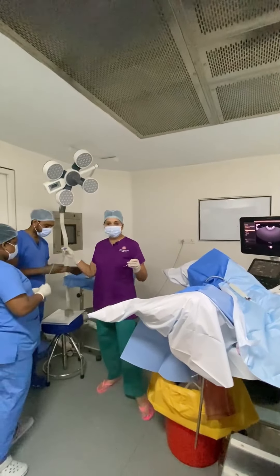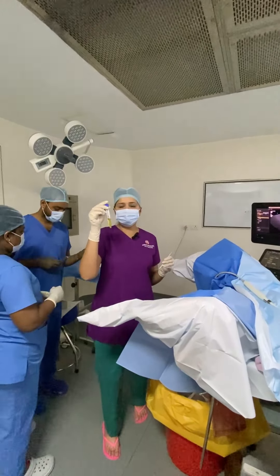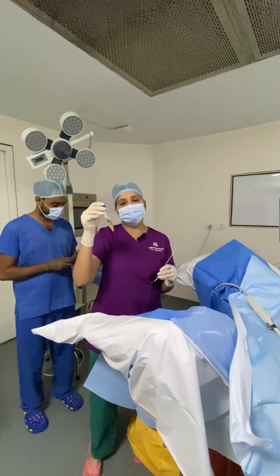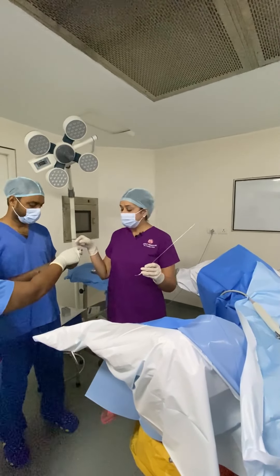This is how we have prepared the PRP. We've taken 8 ml of blood from the patient, and the PRP has been made ready through a centrifuge and some reagents in our genetic lab. Now we're going to collect this PRP into the tube.